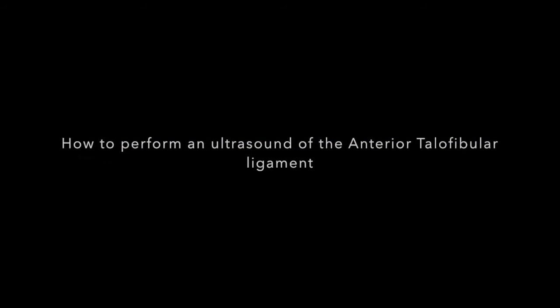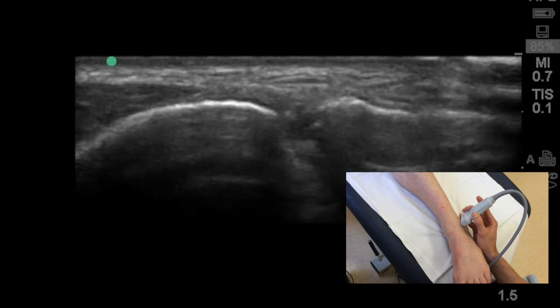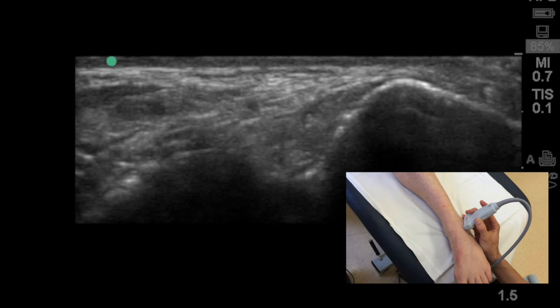Welcome to this brief video on how to scan the anterior talofibular ligament of the lateral ankle. Starting off, it's useful to use the bony landmarks higher up the leg, using the fibula on the right of the image and the tibia on the left of the image.